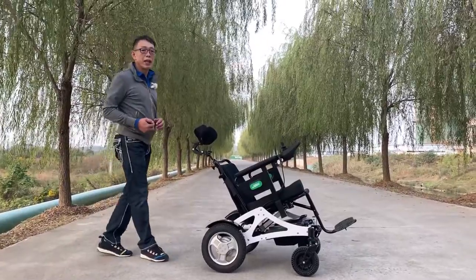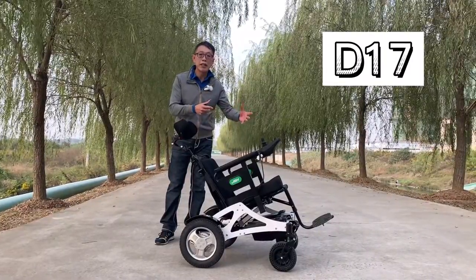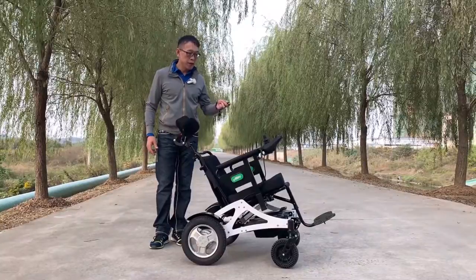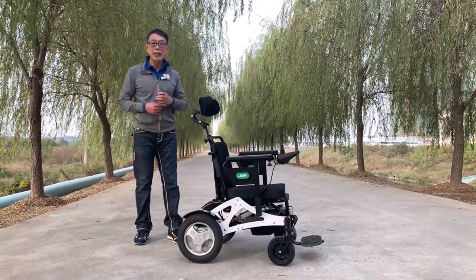Hello, my name is Kevin from JVH. Today I'm going to introduce a brand new model which allows you to adjust the seat angle through a remote control. Very simple, easy, and convenient.